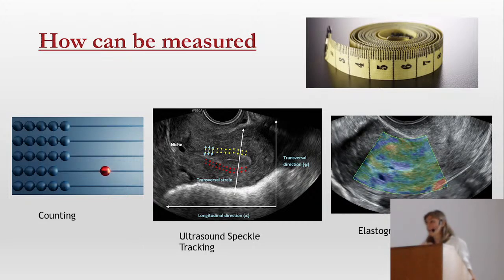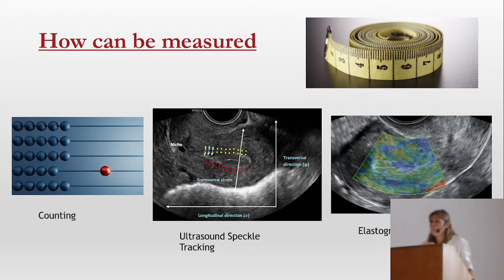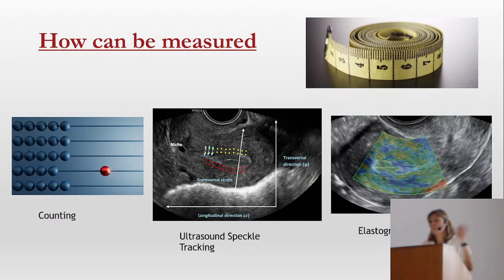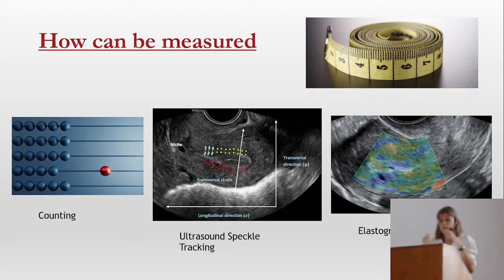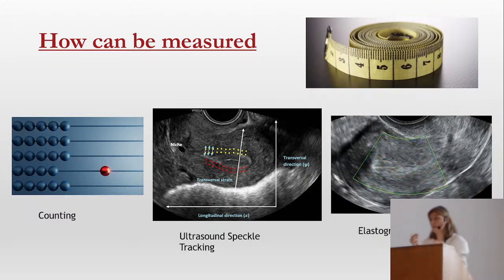A Belgian team is working with an engineering university, but it's semi-automatic. The problem is these markers, these tracks, are placed manually, and then the machine is analyzing the movements of these marks.